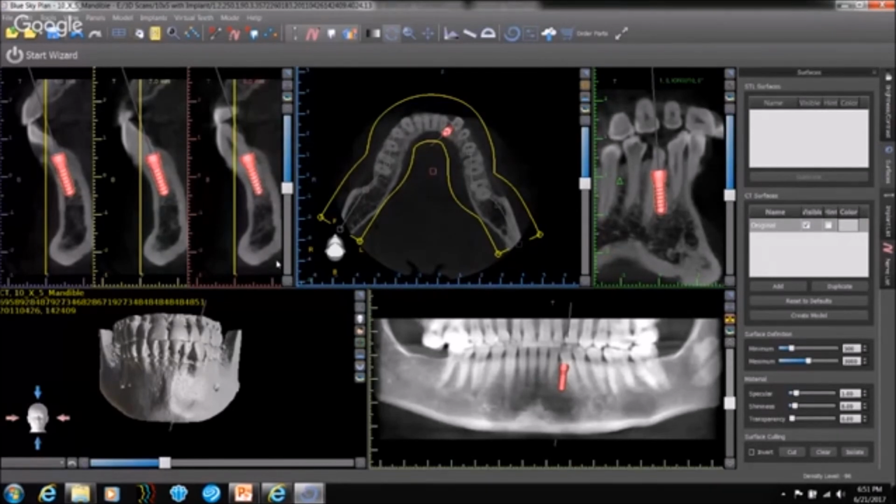Second, there's also a little bit of misconception about using Hounsfield units. For those of you who know, this is nothing but a tissue density measurement, but there's a slight problem with this. Hounsfield units are designed for regular CT images, not CBCT images. Software, even like Blue Sky Bio, does give out Hounsfield units. It is not because Blue Sky Bio software is bad or they are doing something wrong. They are actually doing it right.